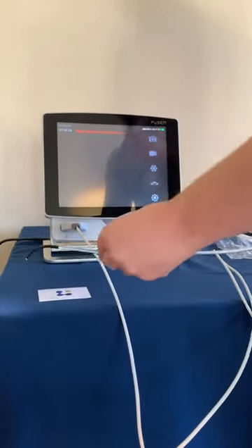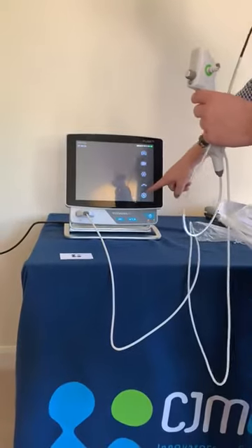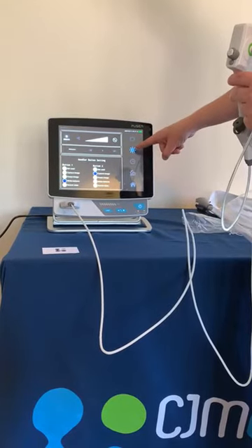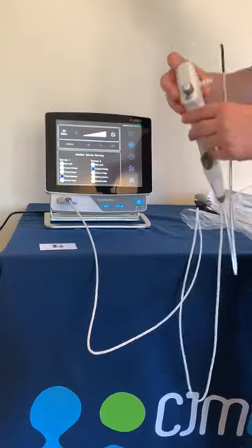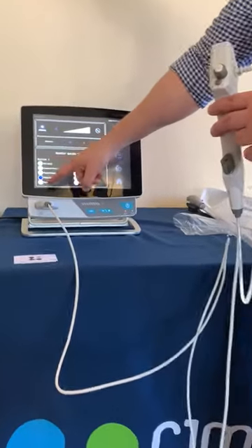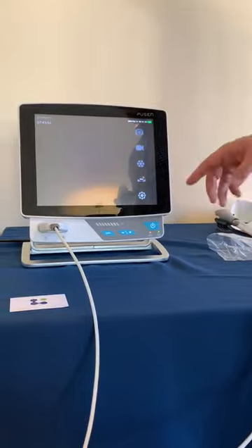There we are — white balance is complete and we can carry on with the bronchoscope. If you want to change the settings, press the settings button at the bottom, then the second button from the top, and this is where you can customise what you would like this button to do. Mine is set to white balance, but you can change that to do freeze image, capture image, or record. You can also use the touch screen buttons.